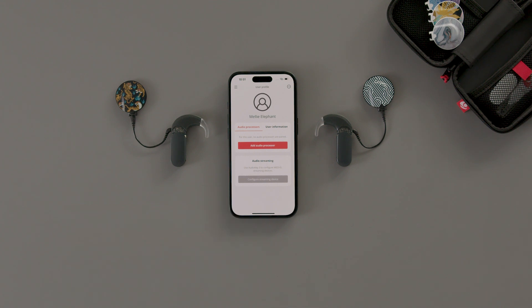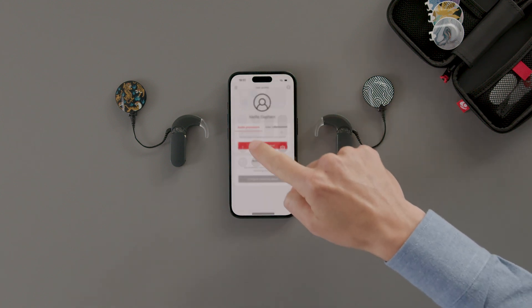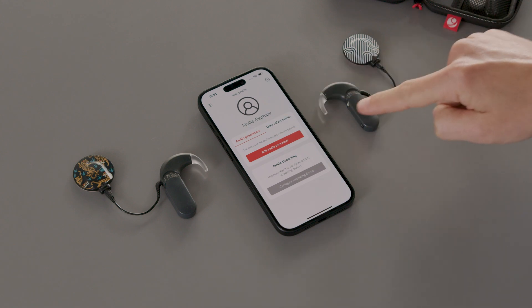If you are using Audio Key 3 for the first time, make sure you have Bluetooth enabled on your phone, and your audio processor is switched off.